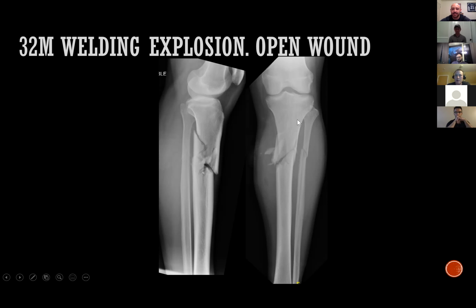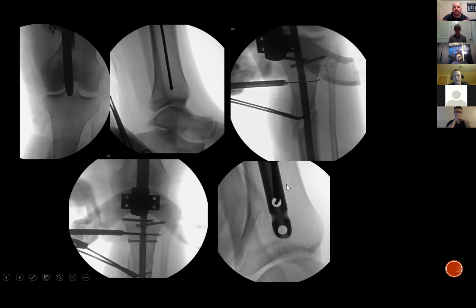And so the nail is not going to fill the space here. So this top part, the proximal part of the tibia, can kind of windshield wiper. If you imagine there's a nail here, it could windshield wiper back and forth on it because there's so much capacious space here. So this is getting a little bit closer to what we would call extreme nailing. This is a tougher case to do. This is a metaphyseal fracture, not a diaphyseal fracture.